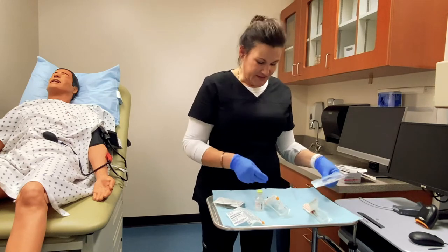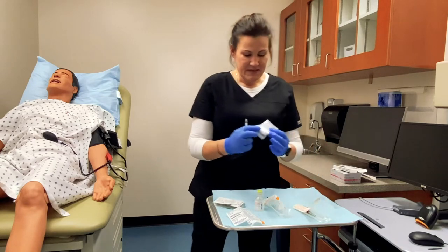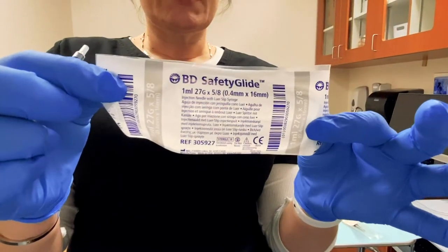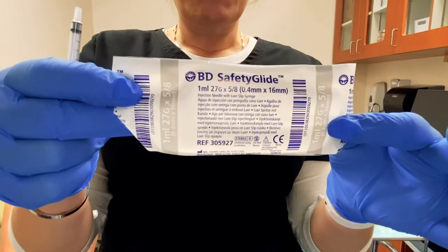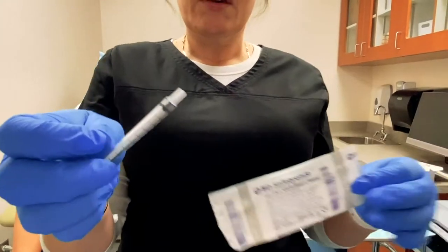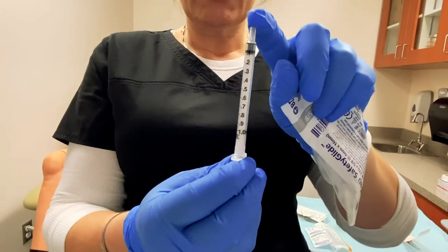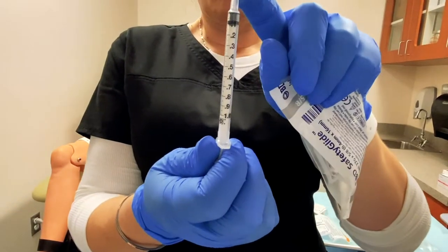The first syringe I'm going to show you is the TB syringe. The TB syringes are normally 27 gauge by 5/8 inch, though sometimes they are 27 gauge by half inch also. You can see that these tuberculin syringes are very small — they only have one mil capacity and they are short and thin, very skinny because they don't hold very much.